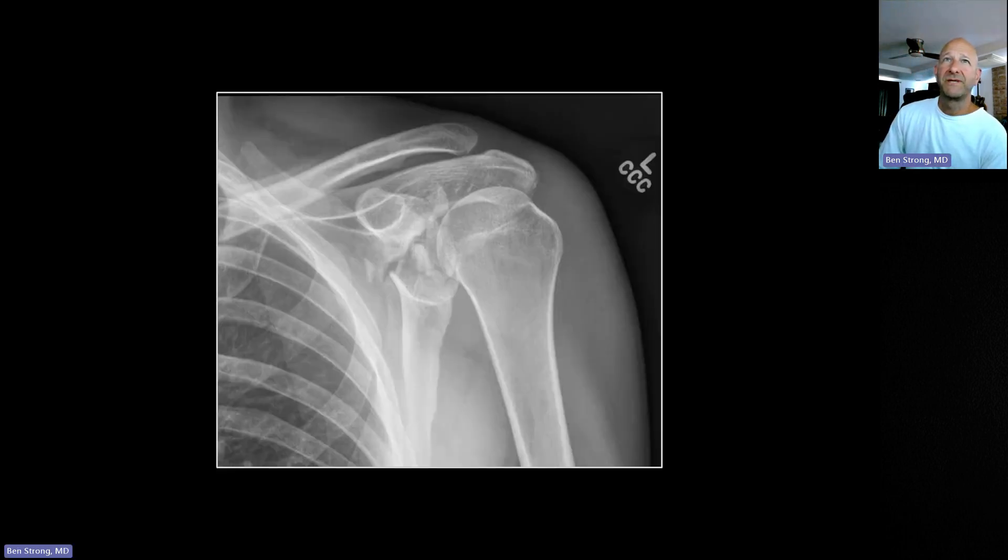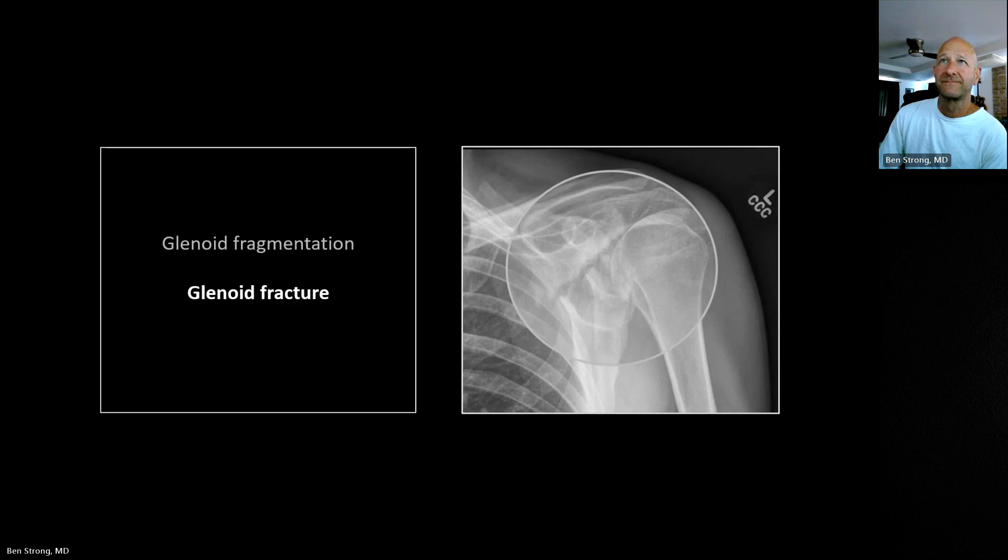Just for completeness sake — not subtle, right? A comminuted fracture of the glenoid. That one my mom, the English teacher, could probably have spotted.